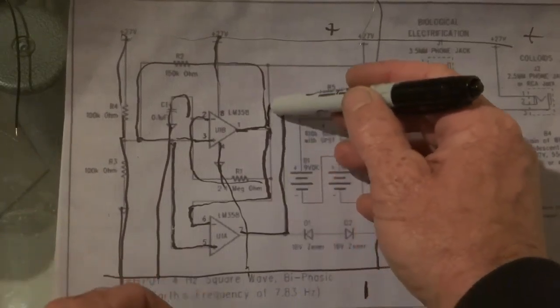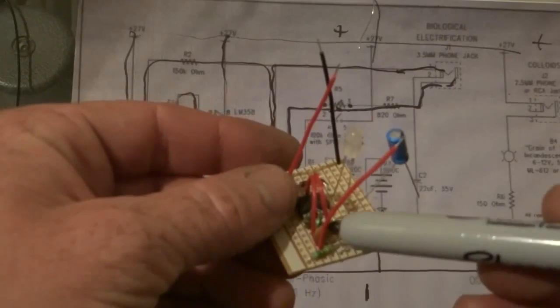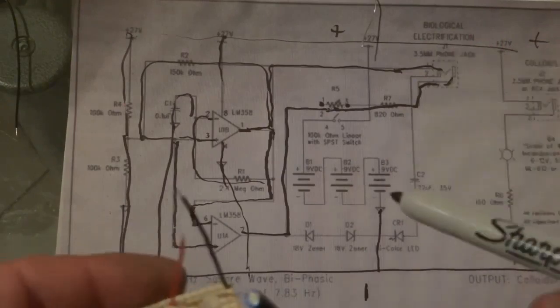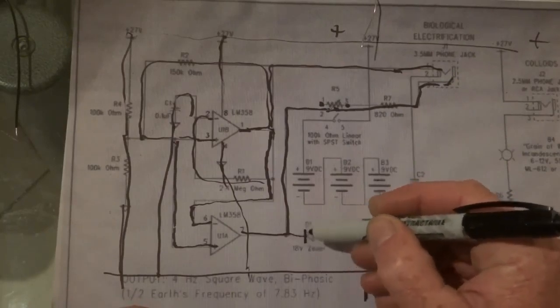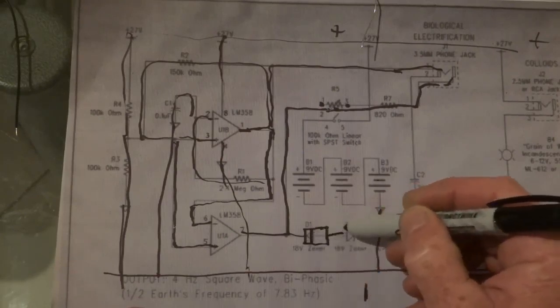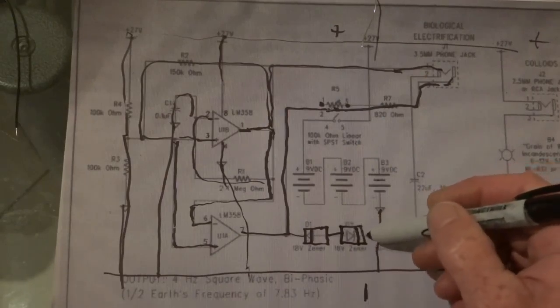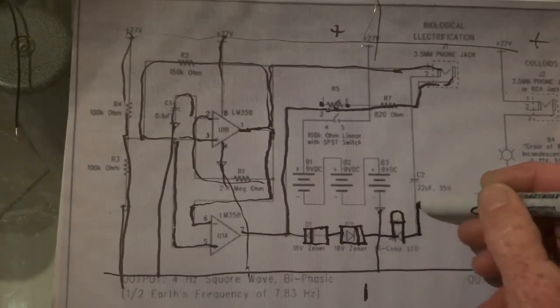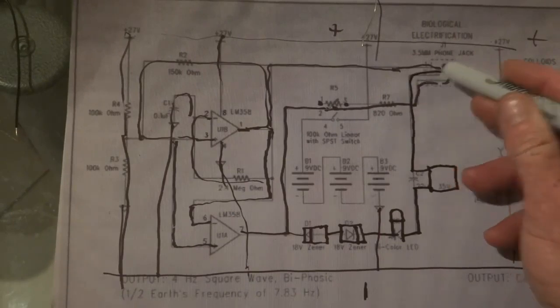Then we have this one here that comes out, which goes to the plug — that's the number one wire, which basically comes out of number one and goes to the plug. And then in this bottom section we have the diode — the diode goes that way — and we have our lamp, our capacitor, and that goes to the other plug. That's basically the whole setup.